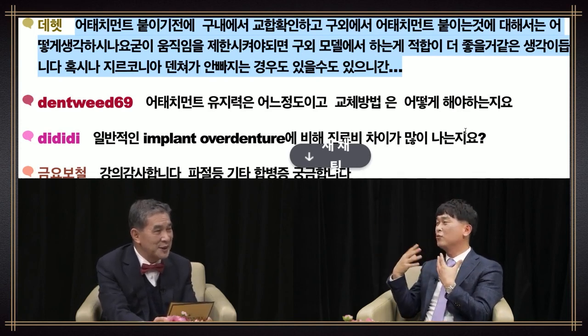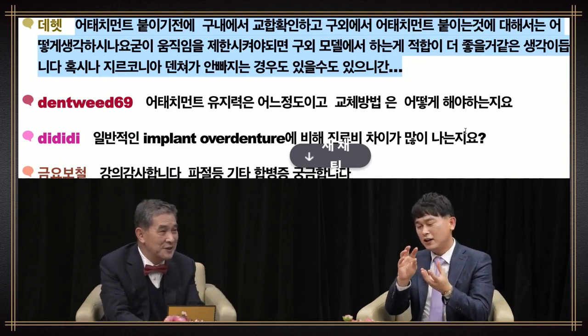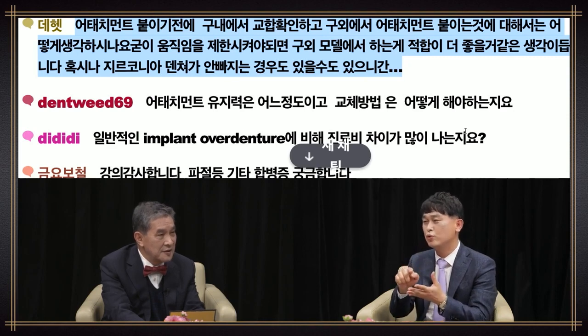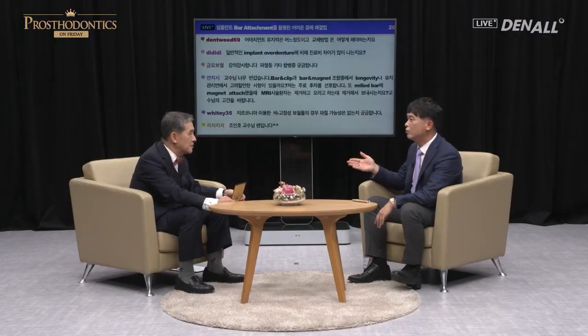It can happen, I believe. The attachment can be attached at a lab, but the attachment will wear down and needs to be replaced by a dentist. So you need to make vent holes to attach it, but it can be attached in the lab and it will fit pretty well, as we already fitted it on the bar.